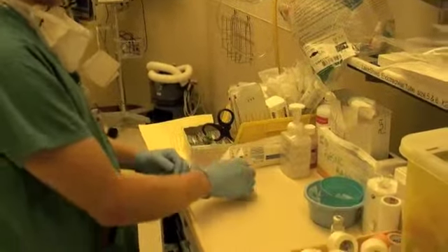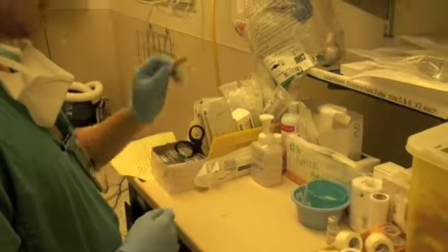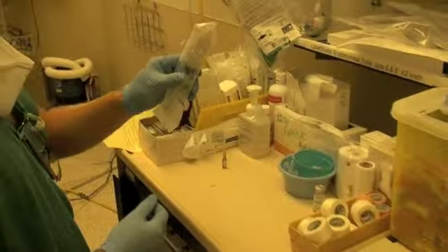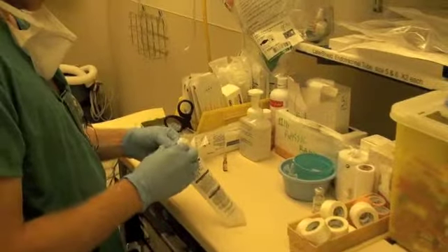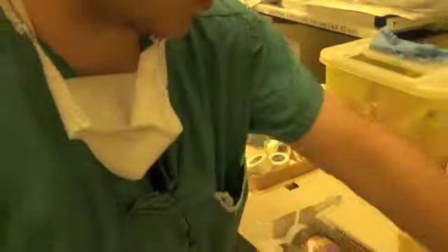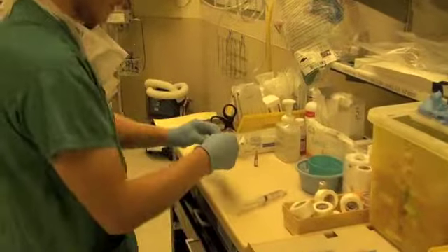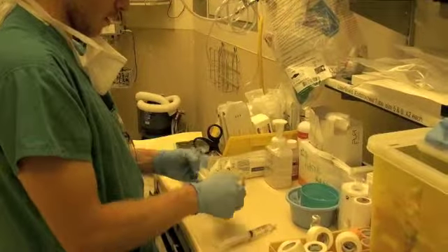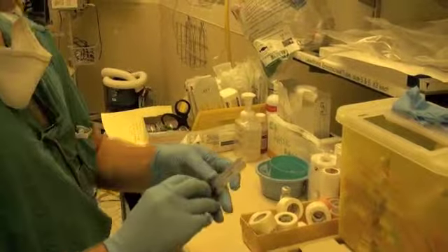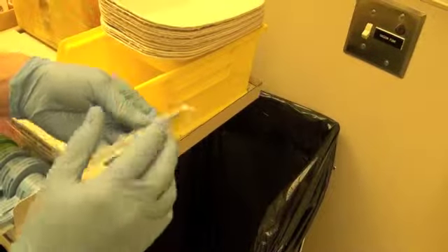Okay, so the third technique we're going to demonstrate here today is diluting 50 milligrams per milliliter of ephedrine 1 in 10. So we're going to get one of the preloaded syringes. This is preloaded with 10 milliliters of normal saline. And so to make a 1 in 10 dilution, you need to first get rid of 1 milliliter of normal saline. Just get this syringe out. So I'm just getting everything ready here. So we'll just get rid of the first milliliter of normal saline into the garbage.